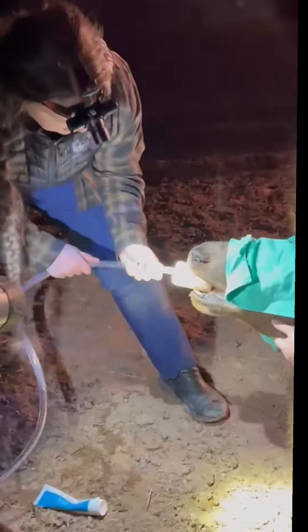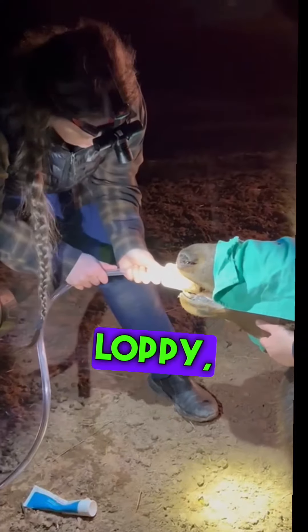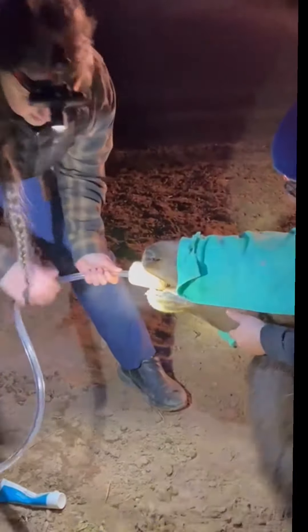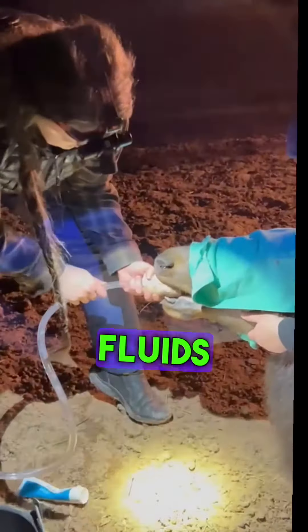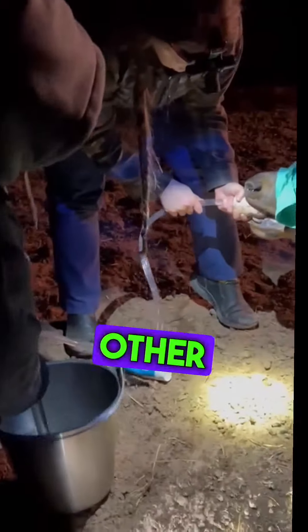We had to do this several times with Loppy. If you haven't seen the full video of the story of Loppy, I'll post it in the comments. Now she's working the tube in, and then they'll start pumping the fluids back into her body, and then we'll start working on the other end.